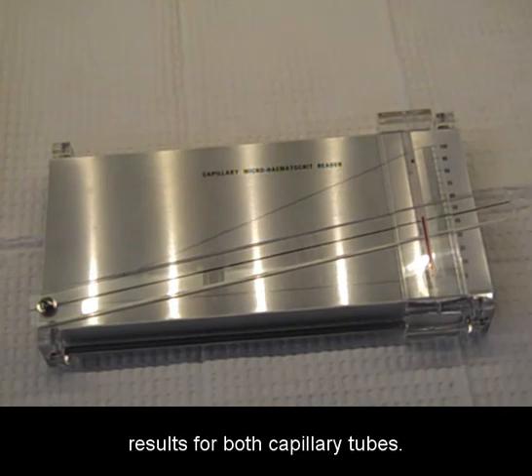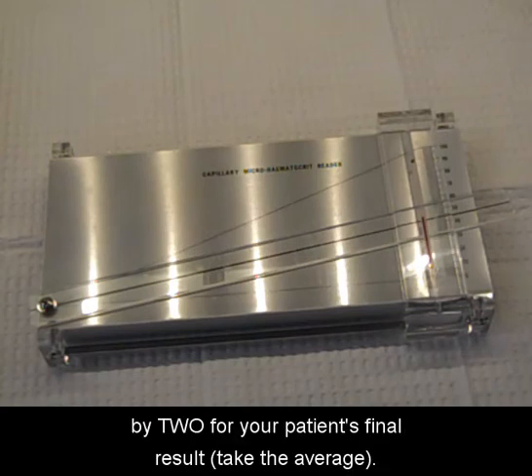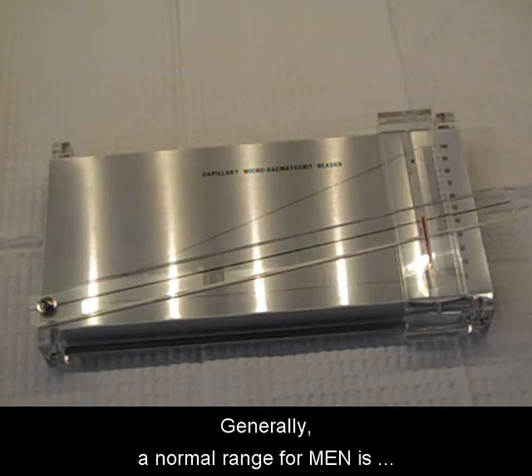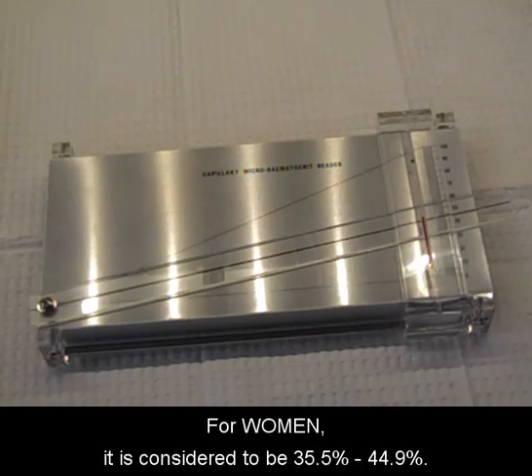You will want to read the results for both capillary tubes. Add those two results together and divide by two for your patient's final result. Generally, a normal range for men is considered to be 38.3% to 48.6%. For women, it is considered to be 35.5% to 44.9%.